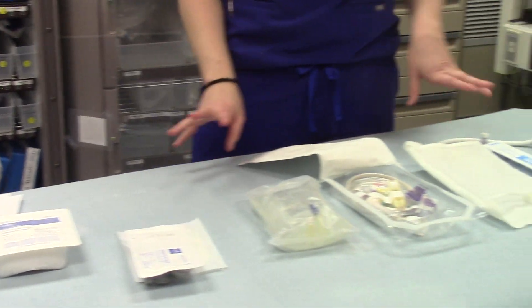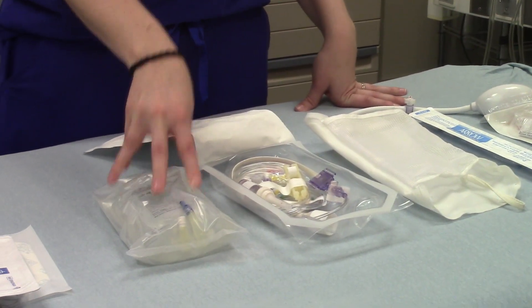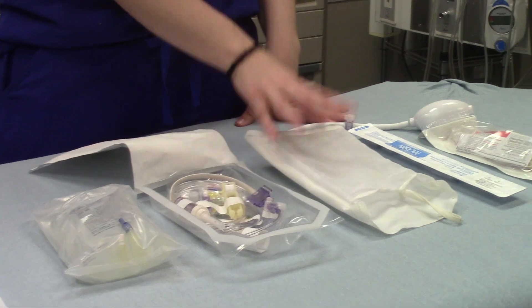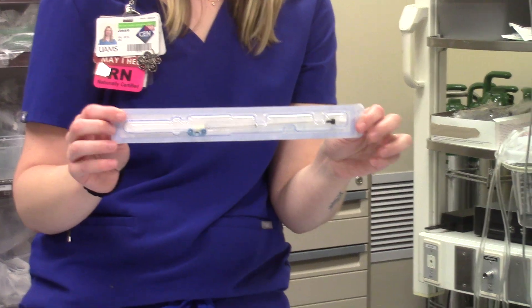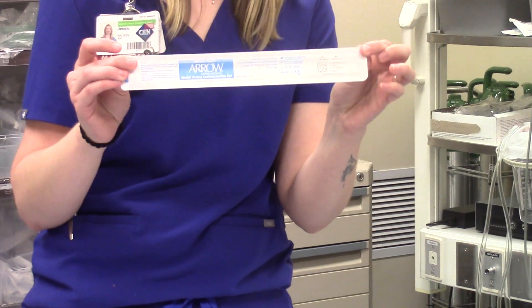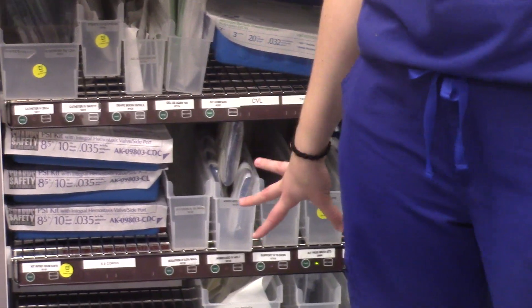To actually get your setup ready to go, you're going to need a 500ml saline bag, a transducer kit, and a pressure bag. The physician will need the art line catheter for the radial artery — they usually prefer to use longer ones. All of this stuff will be found in the supply area here for the most part.